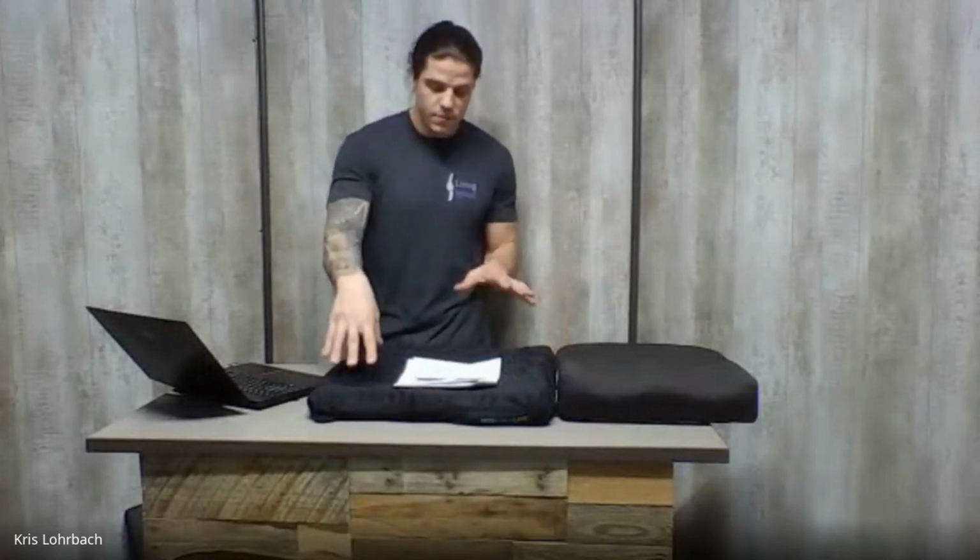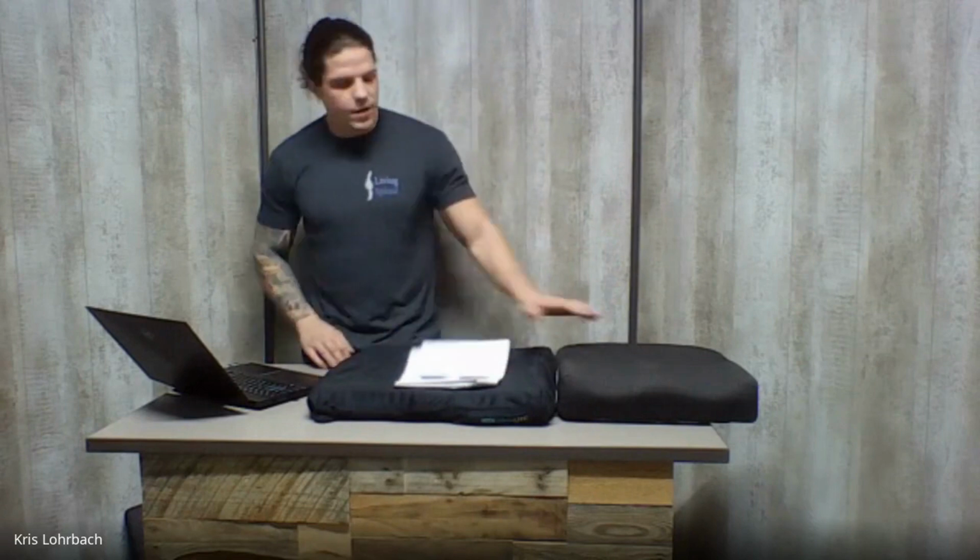Good question. And there are benefits. I mean, talking about the contour, it sounds like, oh, that sounds great. Why aren't all cushions contoured? Well, there's benefits of a non-contour. And the benefits are, one, they allow for more freedom of movement. So if you're sitting in a contoured cushion, it's harder to move around, reach, grab things, and just be mobile. So actually, most wheelchair users prefer a flat cushion. And also, a flat cushion just fits everybody. Most flat cushions are off-the-shelf cushions, so anybody can buy it, sit in it, and it'll usually work well for them. So contours are just more specific.